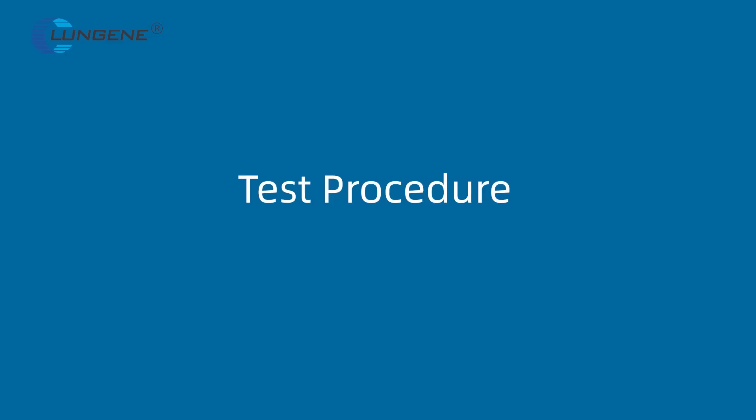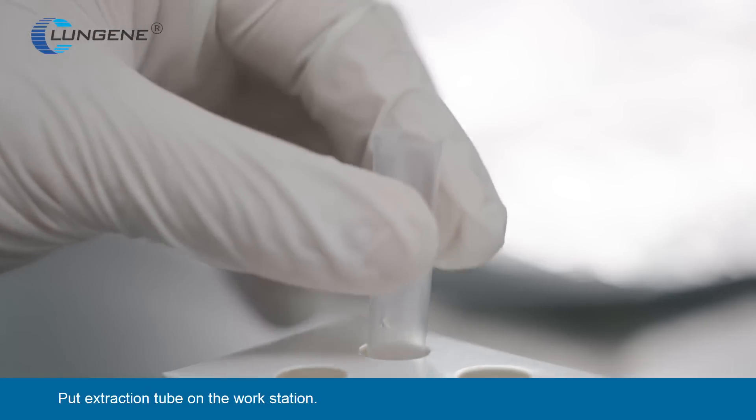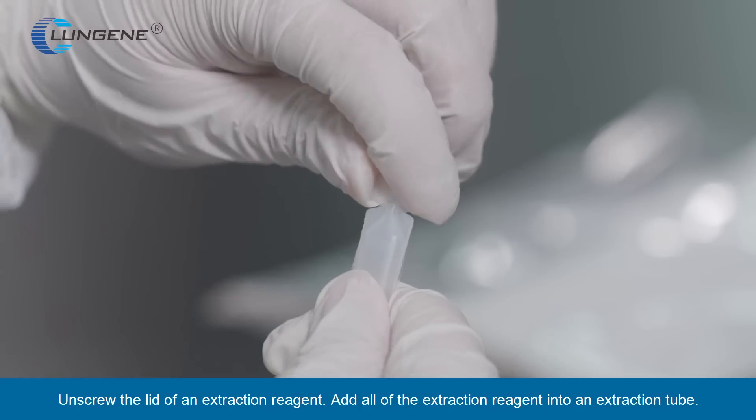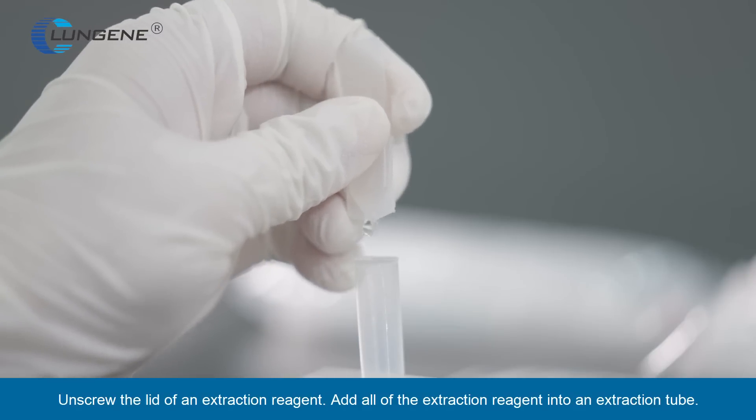Test Procedure. Put the extraction tube on the workstation. Unscrew the lid of the extraction reagent and add all of the extraction reagent into the extraction tube.